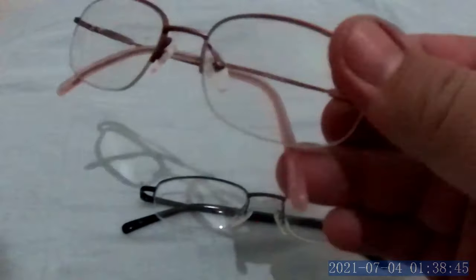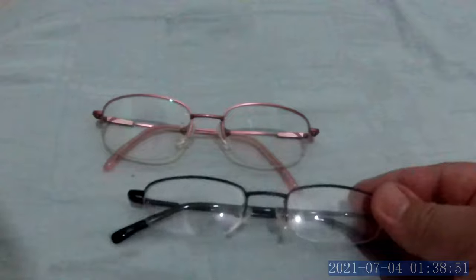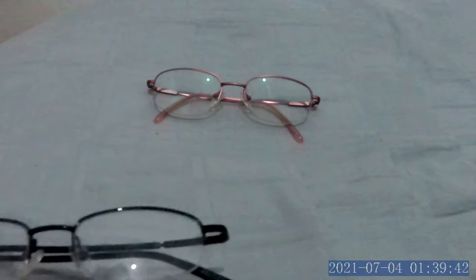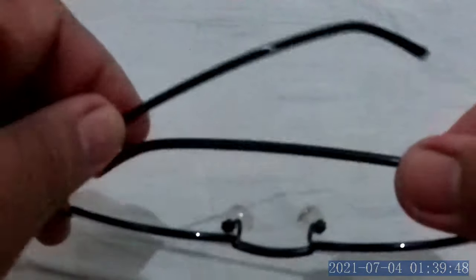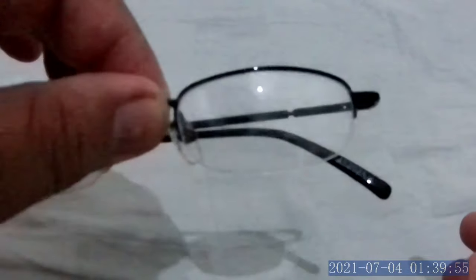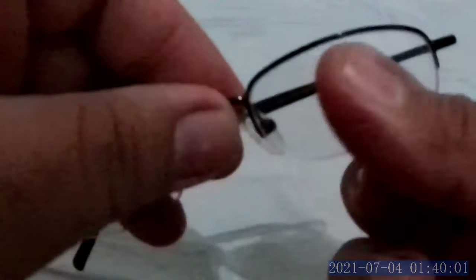I'll teach you the different ways to remove and insert lenses on this kind of frame. First, we'll remove using the force method. You need to hold on the nose bridge, and then on this part of the lens you need to hold it tight and try to pull down.